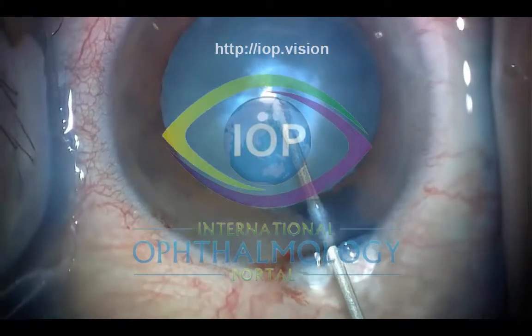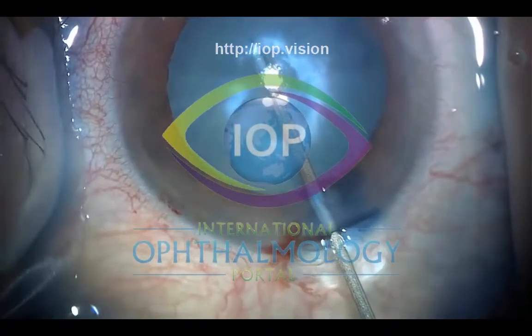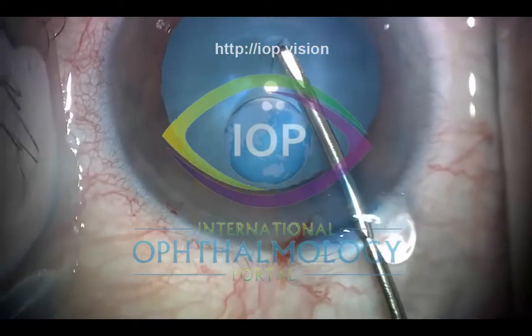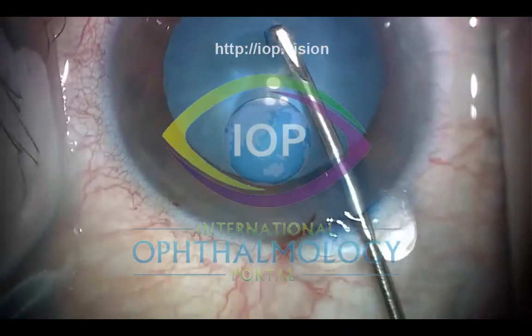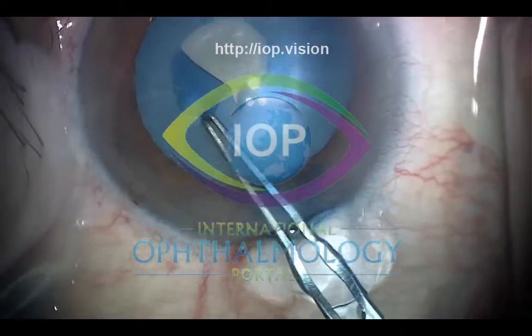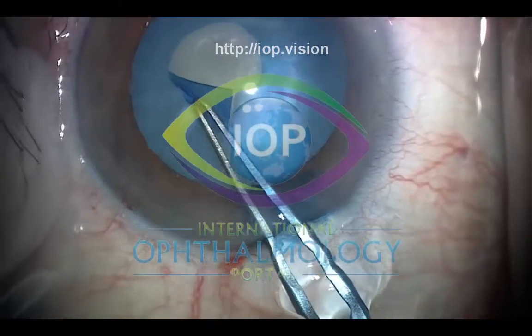Now I'm going in with a needle, because this is something we discussed previously — what's the best way of decompressing the lens. I find going in with a 25-26 gauge needle is most controlled, and that way I know I'm not going to get the rhexis running out because of high intralenticular pressure. It's on an empty syringe — you just put it in, aspirate, and try to get fluid out.